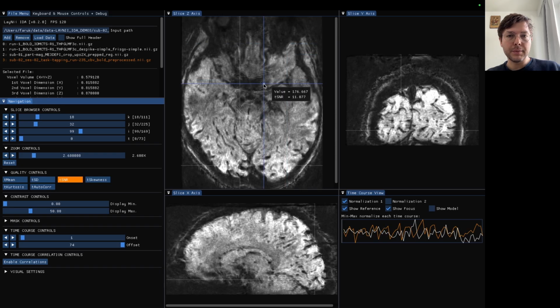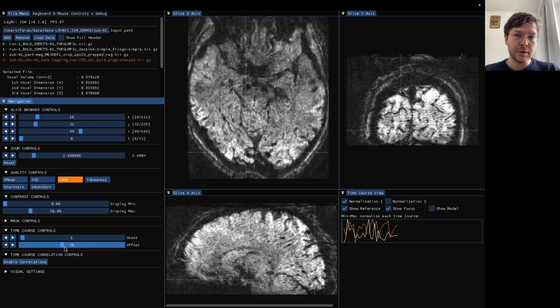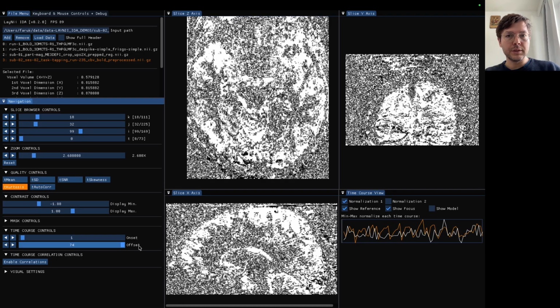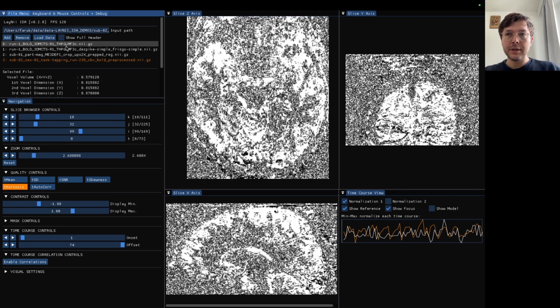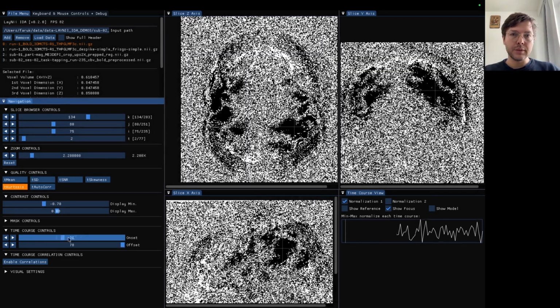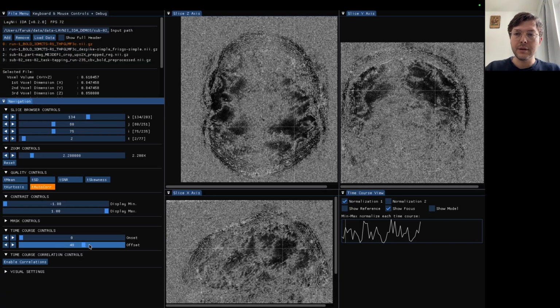And of course, at the same time, just to show you, we can disable the correlations and, for instance, look at the TSNR metric and just cut our number of samples from around 70 to 20s and 30s, then you immediately see the effect on the TSNR map. See? Or let's do it with the kurtosis. This is the full data set. This is the cropped data set. And similarly, in the data set that I have shown you at the beginning of the video, we can do the same. You see, these are all computed in real time, so you can build your intuition based on these metrics, how you judge the data, and what would happen if you had half of the data, for instance.